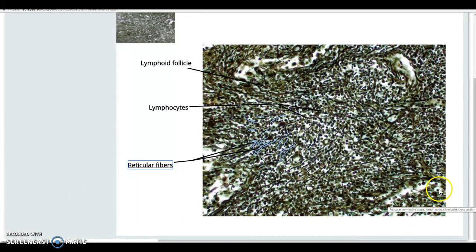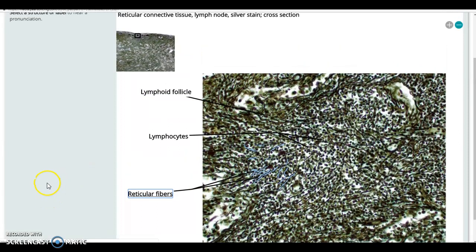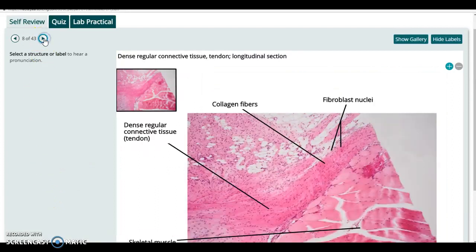You can see the background of little dark reticular fibers throughout the entire slide. And of course, the little dots everywhere are the lymphocytes. They don't really label them very nicely by making that whole thing light up like that. That's a reticular connective tissue.